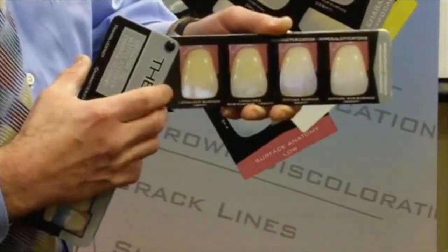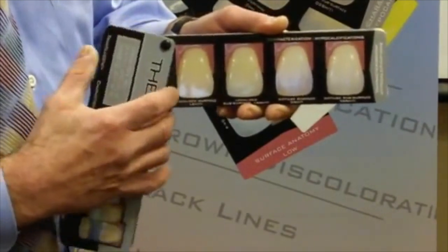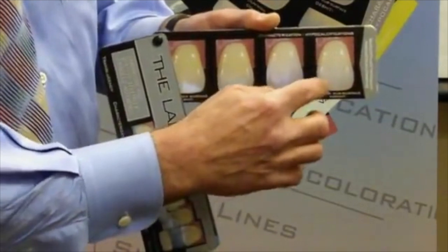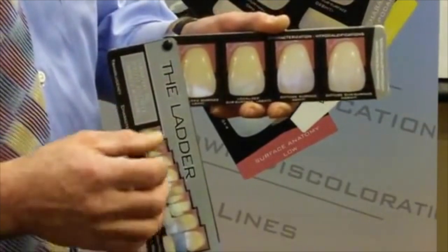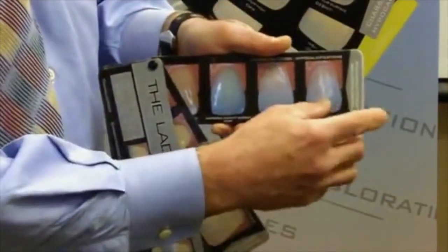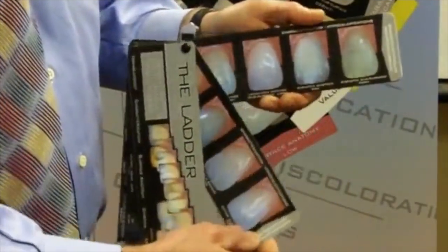So these are real features, real teeth that look exactly as they would clinically. Second image that I wanted to talk about is diffuse surface hypocalcification, which most often dentists map as shade. It's a feature and it needs to be separated as such. Move through more hypocalcifications, every one that might want to be replicated.